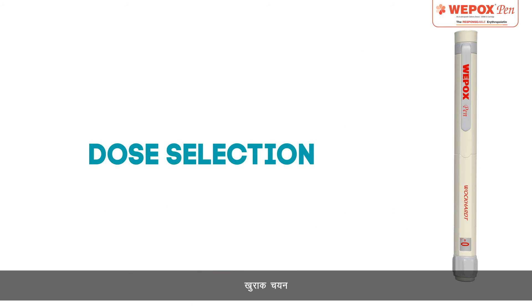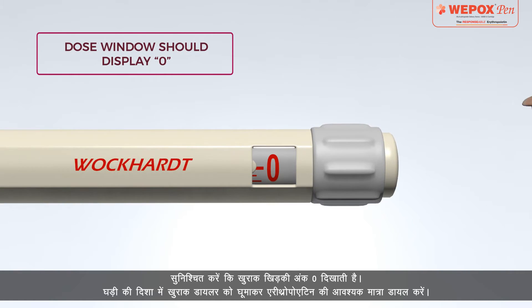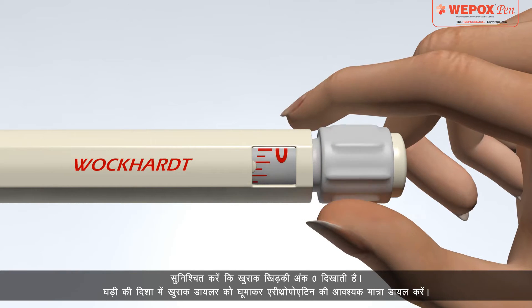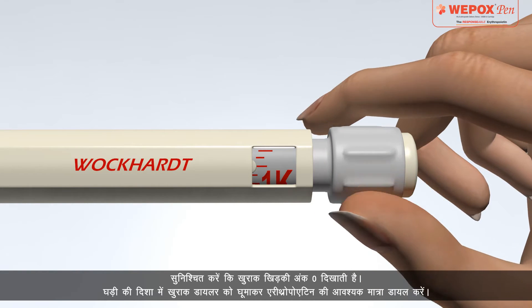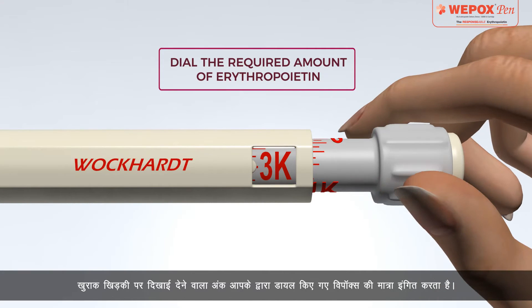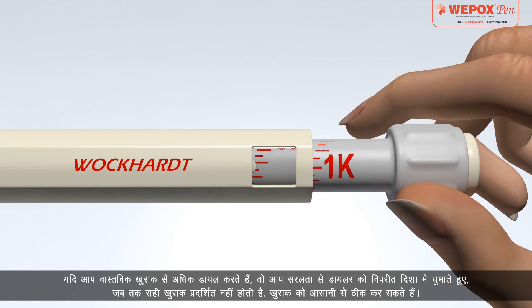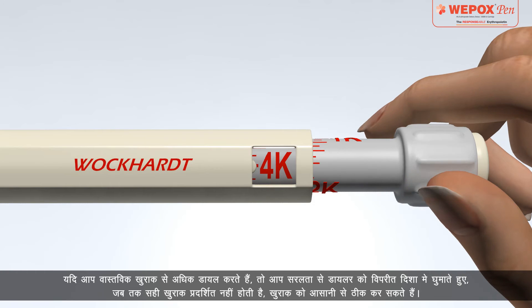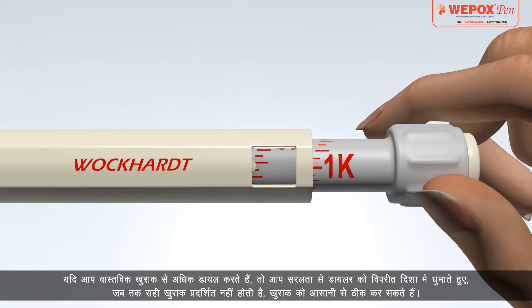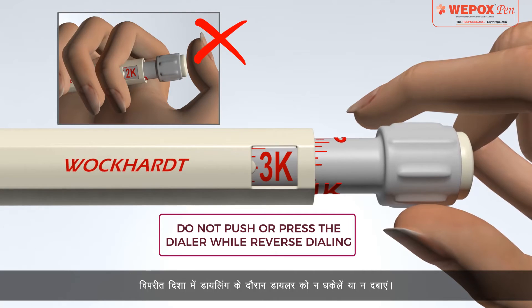Dose Selection: Make sure that the dose window displays digit 0. Dial the required amount of erythropoietin by rotating the dose dialer in a clockwise direction. The digit that appears on the dose window indicates the amount of Wipox dialed. In case you dial more than the actual dose, you can correct it by simply rotating the dialer in reverse until the correct dose is displayed. Do not push or press the dialer while reverse dialing.